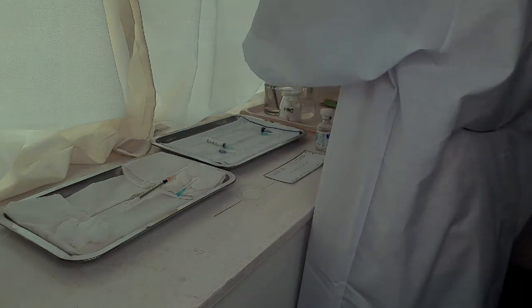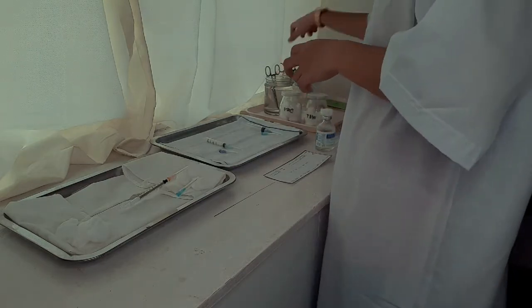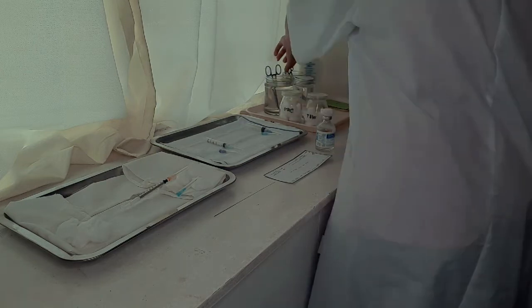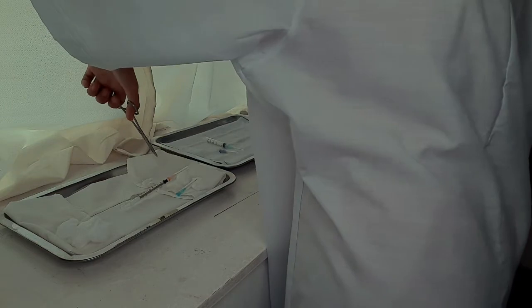Also, don't forget to place 1 wet cotton ball on top of the vial. Disinfect the rubber cap of the vial from top to bottom using wet cotton balls, and also disinfect the hands.